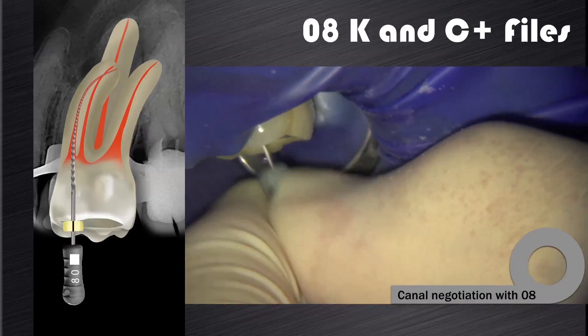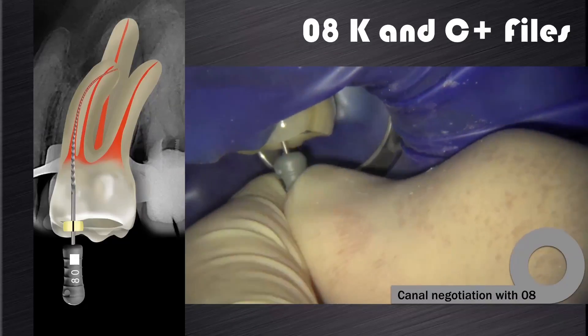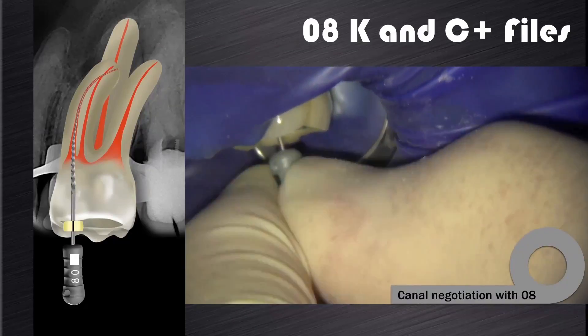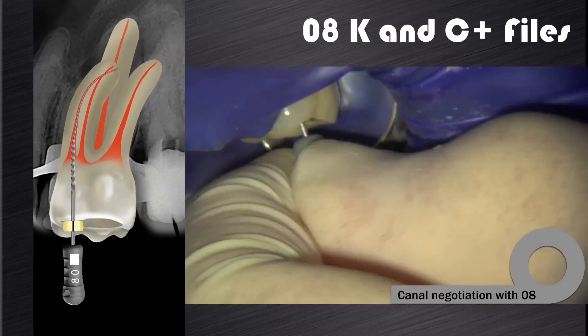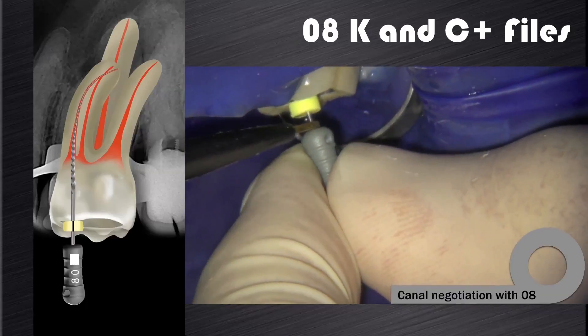After that I will do my working length using an electronic apex locator.